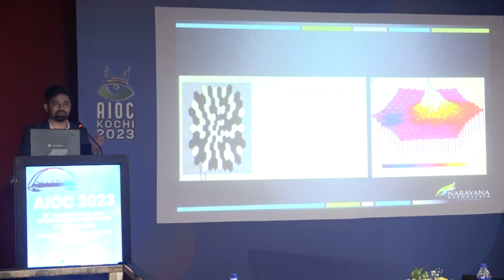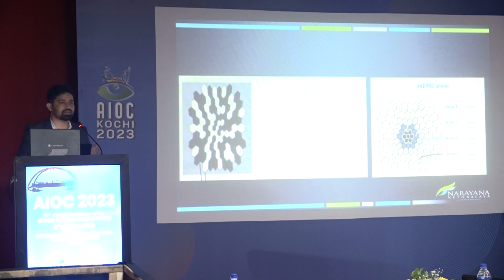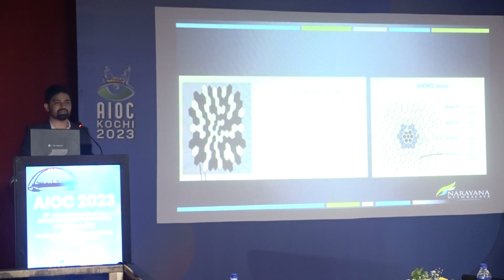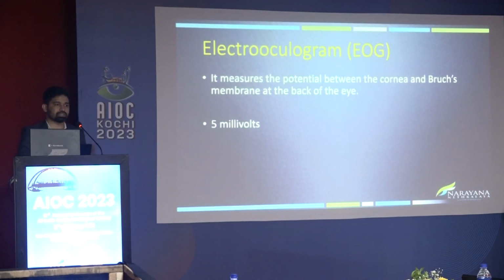Okay, so that's how we detect even a small foci of retinal dysfunction. Where do you use this commonly? You must be getting a lot of referrals from your rheumatology department, right? In HCQ toxicity, mainly in drug toxicity, or any case where everything is normal but the patient is complaining, the only thing which can tell us the answer is multifocal ERG. So that's about the ERG.